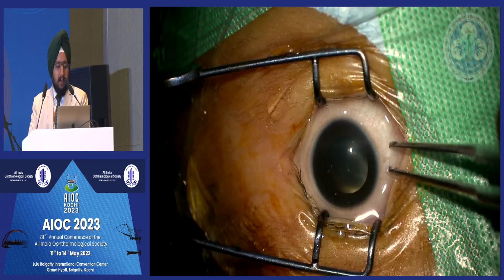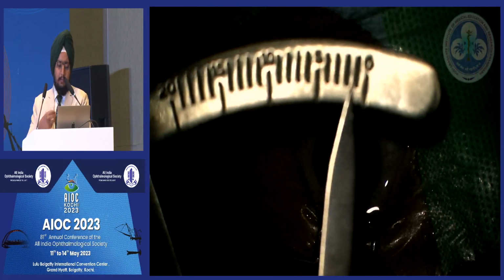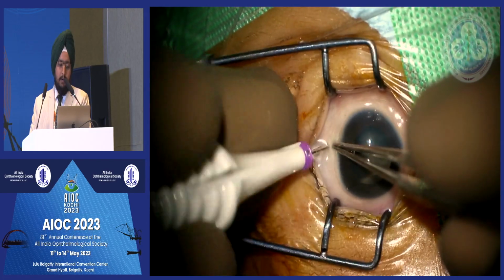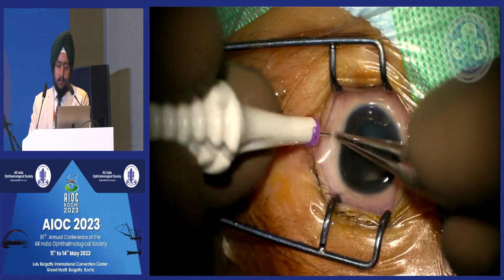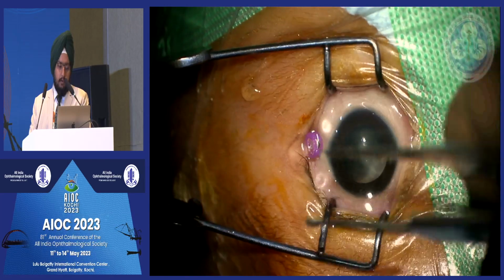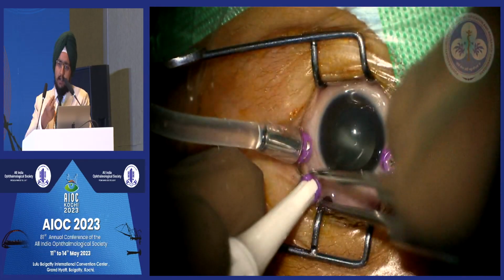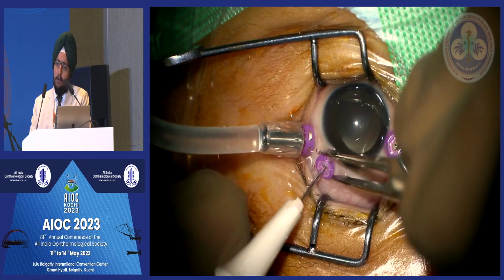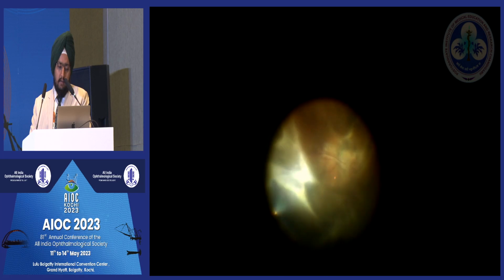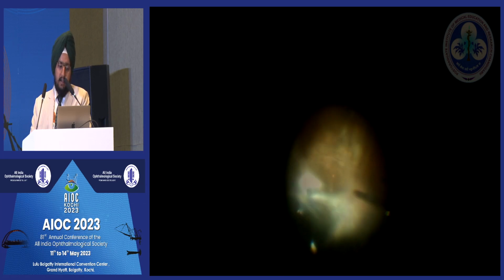So this is the left eye video that I'm going to show first. I prefer to do the eye which I feel has a better prognosis first, because these children tend to decompensate sometime under anesthesia also. So you need to get away with the better eye, giving him better vision first. So this is the stop and slide technique that we have described, because the retina is quite lifted, to prevent directly hitting your trocars into the lifted retina. So you can see how lifted the retina is just behind the crystalline lens.